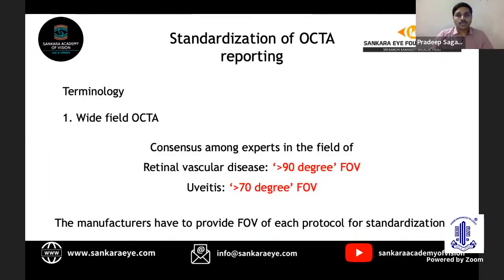Moving on to the terminologies used in OCTA reporting. First, wide field OCTA. There was a consensus among experts in the field of retinal vascular diseases that more than 90-degree field of view should be considered as wide field, and the experts in the field of uveitis suggested more than 70-degree field of view as wide field. So what we need to understand is that the manufacturers have to provide a field of view for each protocol for this standardization.